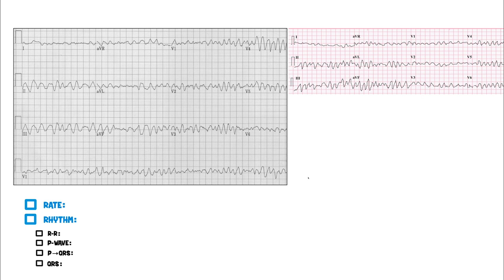This is what you're going to see as V-fib. This is a little bit more of what's called a coarse V-fib, whereas whenever you see something that's a little bit finer, this is a little bit more fine V-fib, almost to the point of asystole.